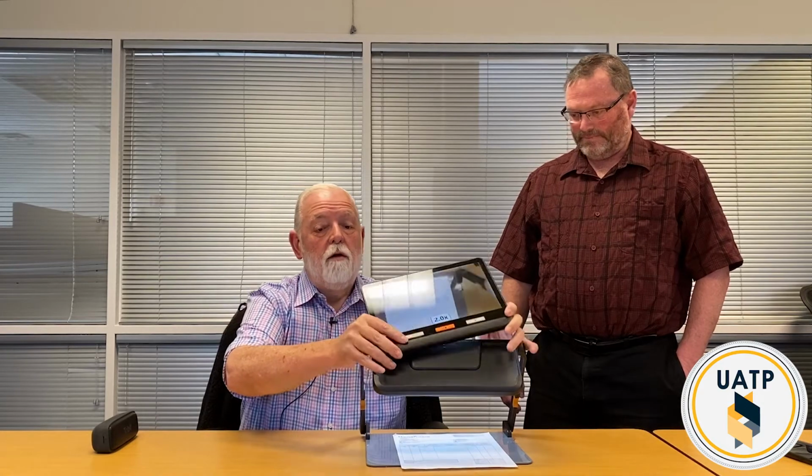This is actually the device itself. You can use it flat on top of a book like this if you want to. You can flip open the stand and set it on there like that if you want to. Or finally, if you put it in this stand, then you have a portable or a small desktop video magnifier, which gives you a writing area or a reading area down here. If you want to write a document or sign something or whatever, you can do that.